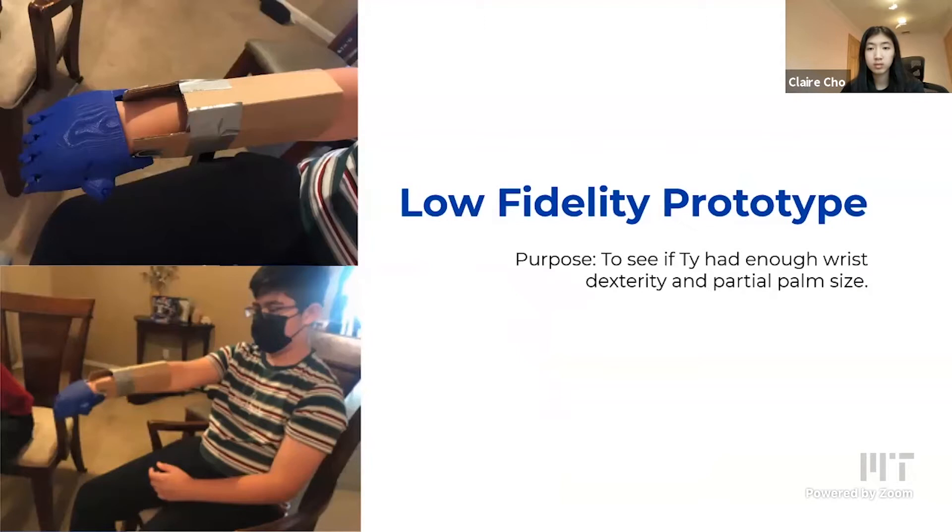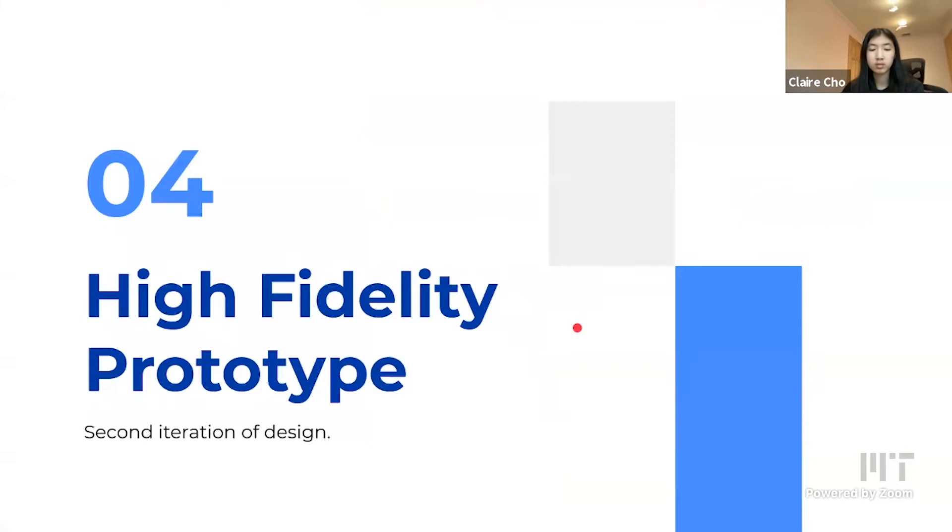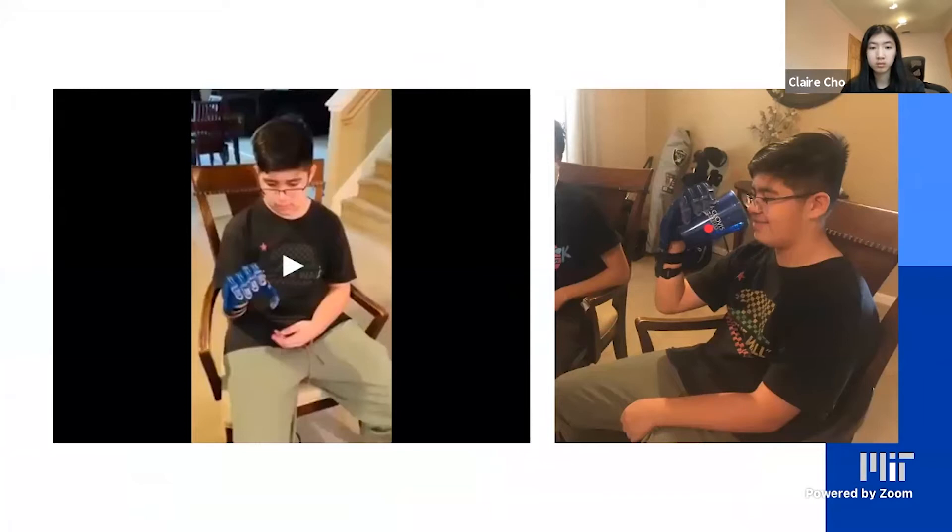For the high-fidelity prototype, we decided to assemble the full hand, scaled at 155% — a little bit larger than my hand. It allows Ty to slip his partial palm into a region, and it includes Velcro straps to tie across his forearm. This is a picture of Ty using the hand and holding for the first time ever a cup with his right hand. And here's a video of him opening and closing the hand — you can see him bend his wrist down to close the fingers and release his wrist to open them.